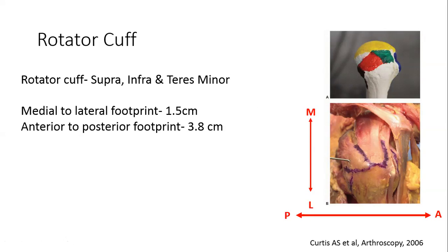So try to get an image of supraspinatus where you see fibers parallel, and you also want to see the rounded humerus and the greater tubercle as a beak. The beak is because of the rounded portion of the head and the greater tubercle. So you want to see this bony anatomy, bony landmark underneath this supraspinatus, and you want to see the area where your long axis is aligned along the fibers of supraspinatus. That's where you have a good image of supraspinatus.